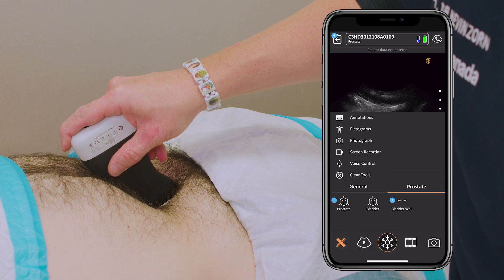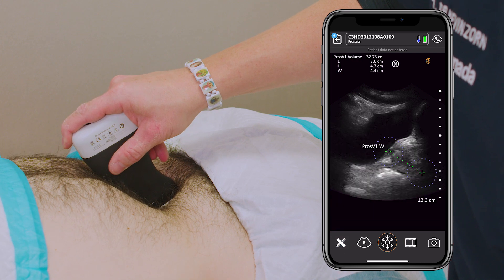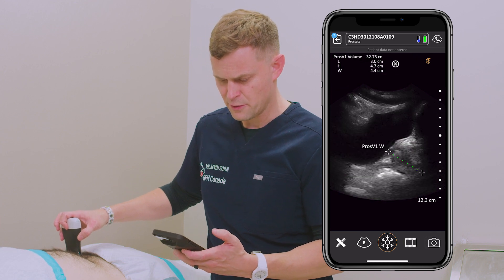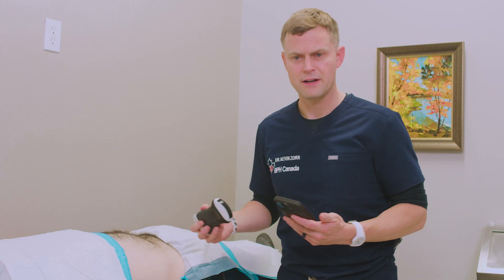You can see the funneling of the bladder neck, and I'll measure it to its width and save that. So there — all within a matter of a few minutes — I've got the pertinent information for anyone with BPH or lower urinary tract symptoms: their bladder status, bladder wall thickness, making sure there's no secondary endpoints of chronic BPH such as diverticulum or stones, and finally the prostate anatomy — length, height, and width — and the absence or presence of a median lobe.